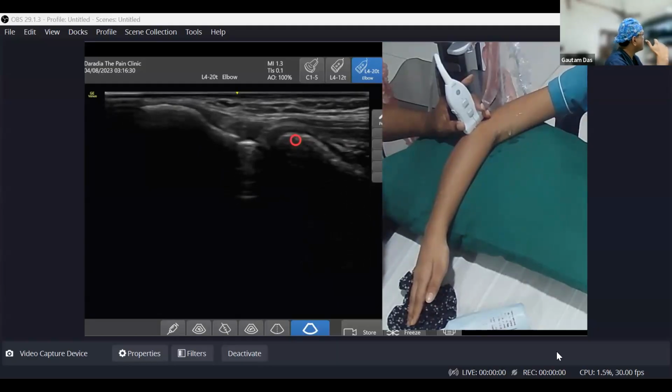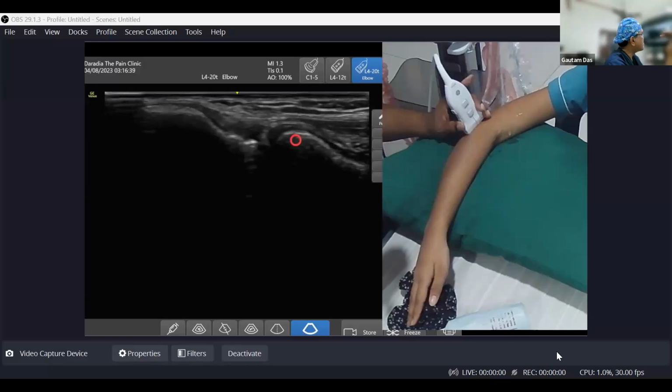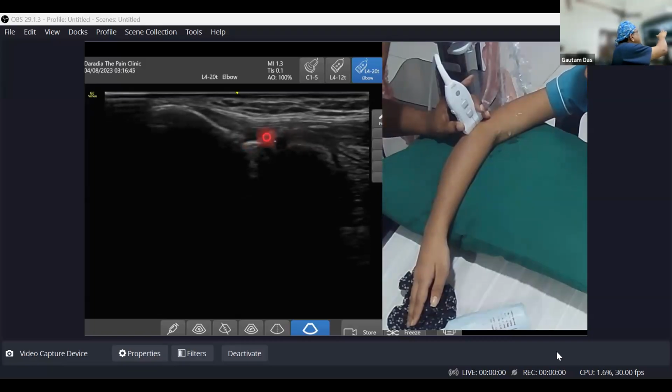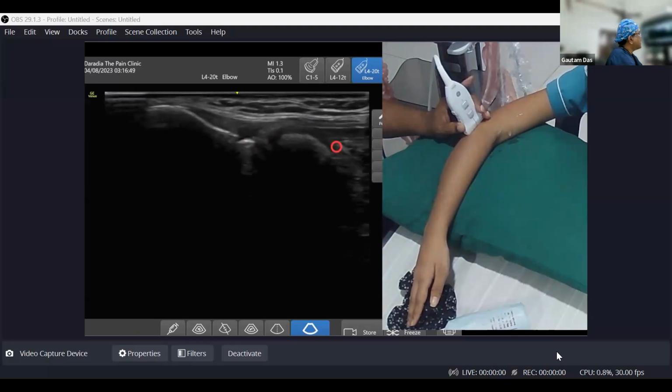So any ligament, whenever you see it, will not be as straight and fibrillar as the tendon. And a tendon has one side attached to the bone and the other side converted into the muscle, but a ligament runs from bone to bone. So this is your ligament, getting attached and intermingled with the annular ligament.